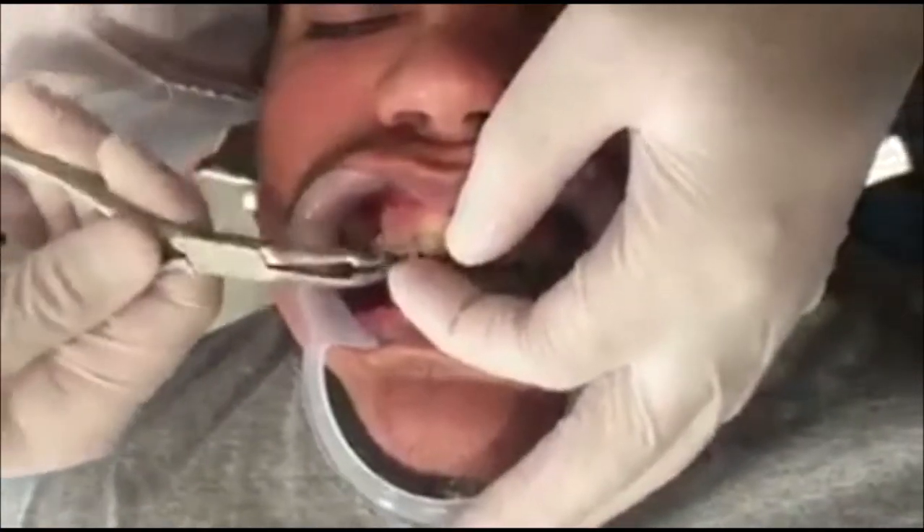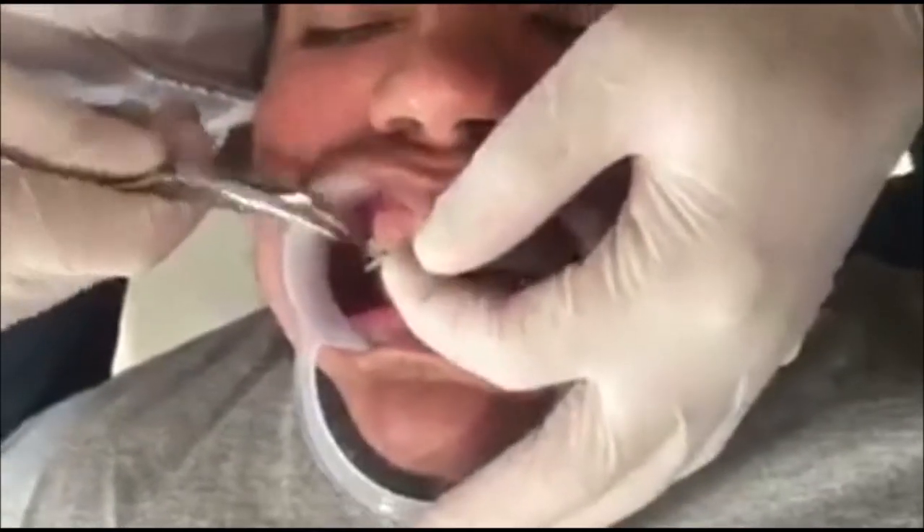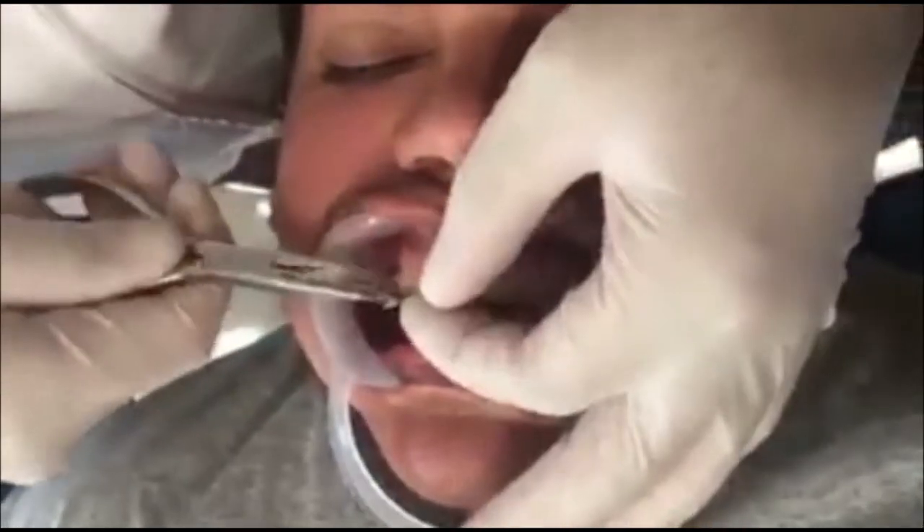On the right side you can see it in the passive state. Now I am activating it, attaching it to the wire again, and closing the hook.